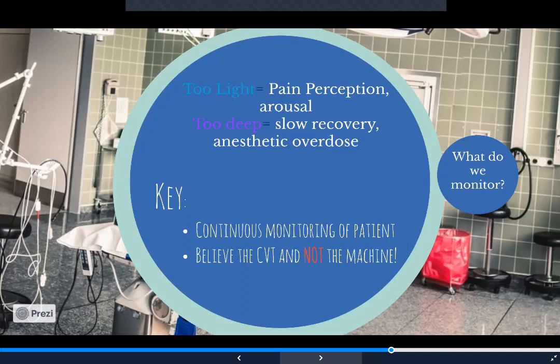We've had it where I was just starting at a vet tech college and I was teaching a surgery. I did not know this, nor did anyone else, but if your vaporizer is not being refilled appropriately, so your vaporizer goes below half, the wick of the vaporizer can dry out. I wasn't there previously, and when I came in, no one had monitored the vaporizer.